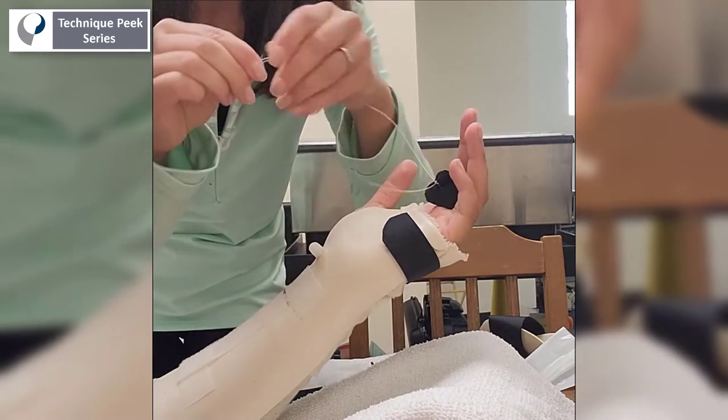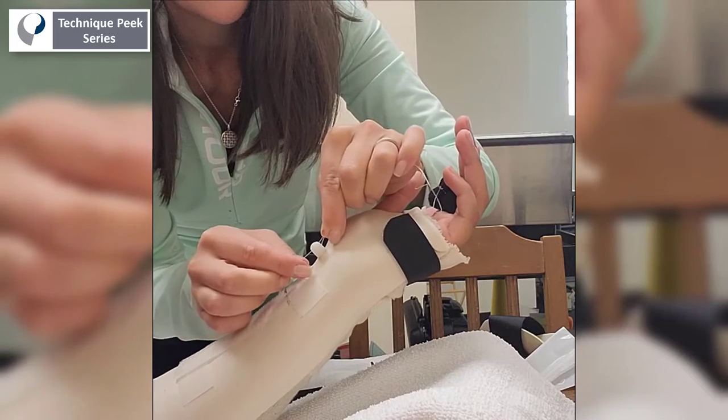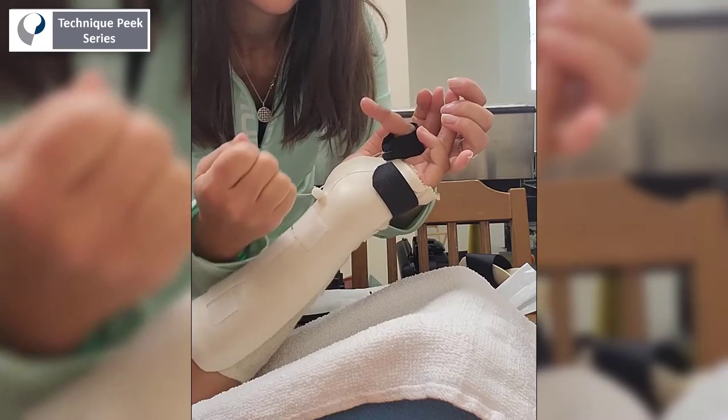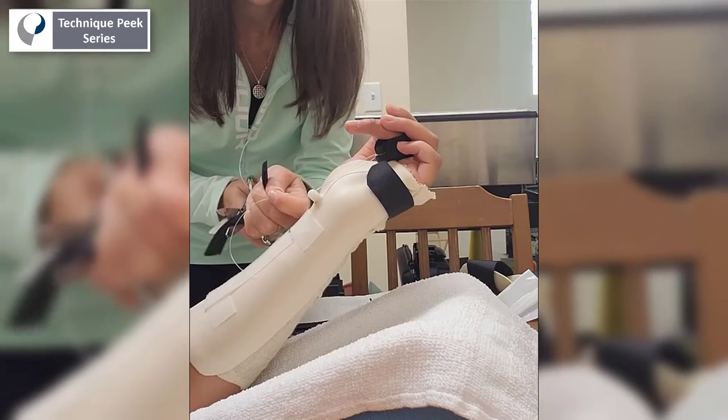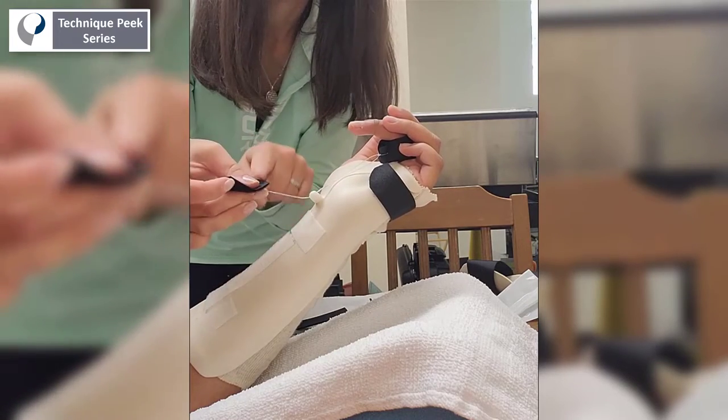Next, we will apply the finger sling and feed the fishing wire through the line guide. Once fed through the line guide, you can apply a piece of loop velcro to complete the dynamic component of the splint.